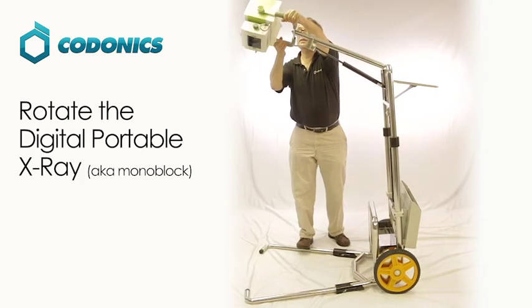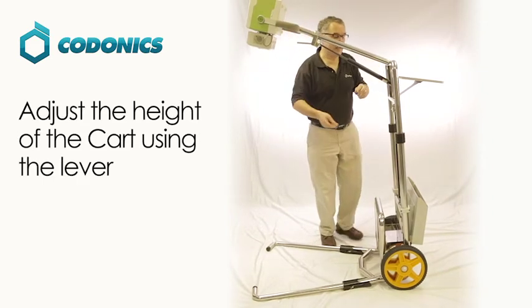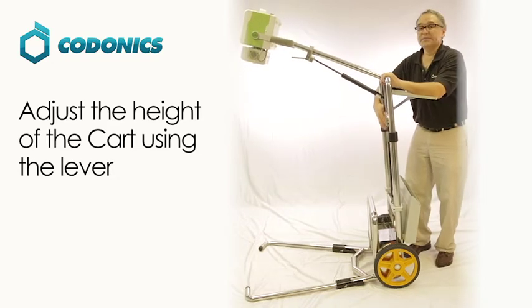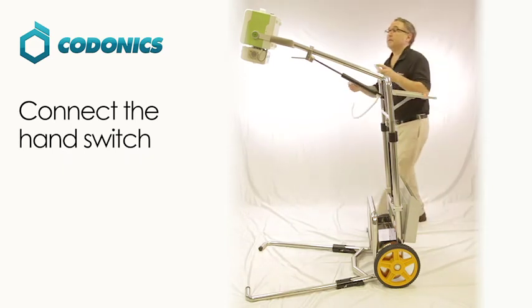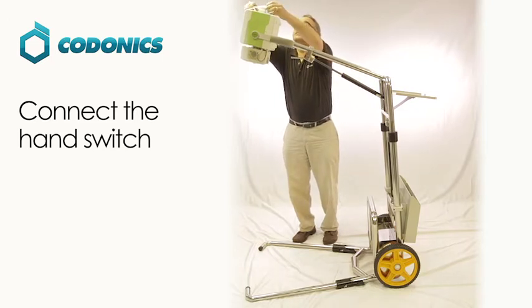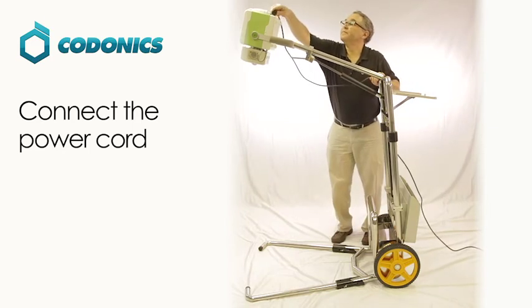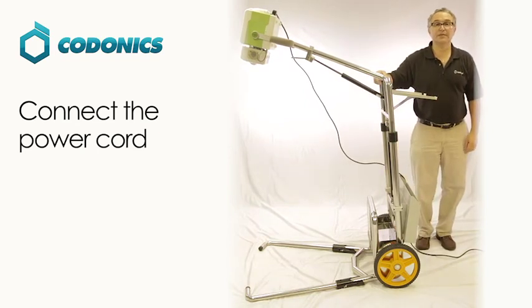You can then rotate the monoblock in place and adjust the height of the cart up and down to your comfortable level. Connect the hand switch to the device and the power. Now you're ready to use your digital portable x-ray device.